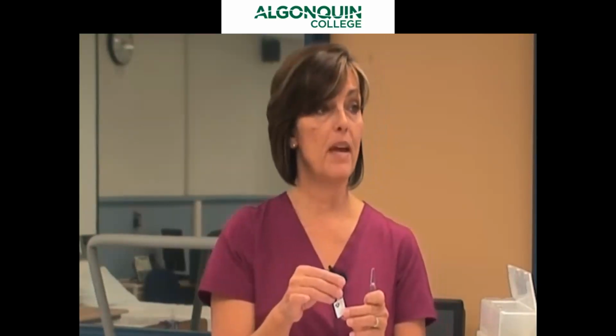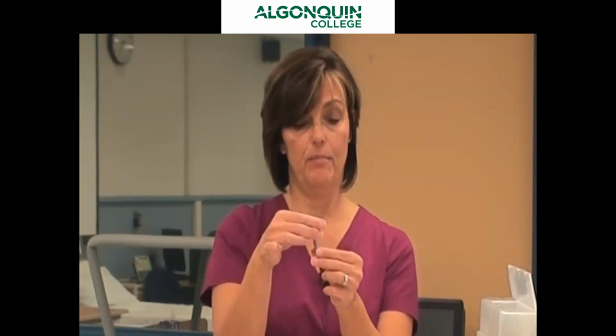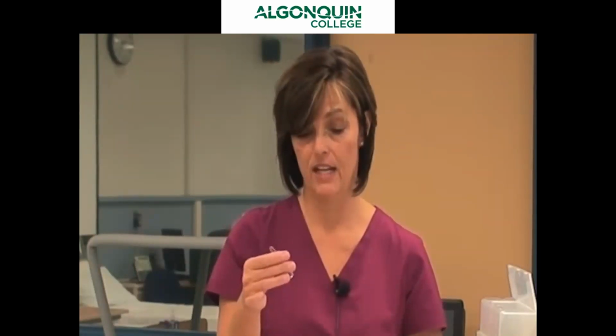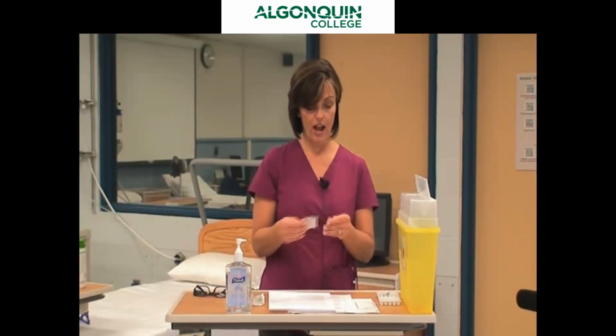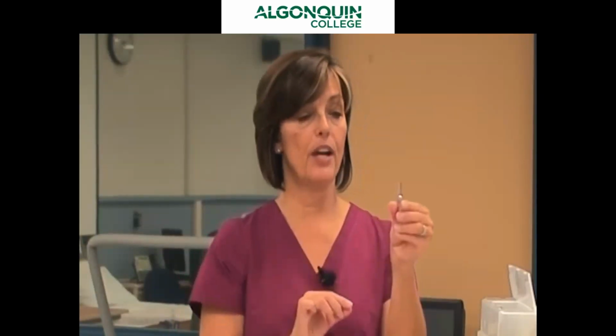Sometimes medications that are in ampoules come with an actual label on them, but this one is embedded in the glass because Gravol tends to be a stock medication on most units in most agencies. So to begin with, we have all our equipment, and we have our alcohol swabs, our Sharps container, our doctor's order, and our med record. I'm going to complete my hand hygiene before I begin mixing. The first thing I'm going to do is break open the ampoule.